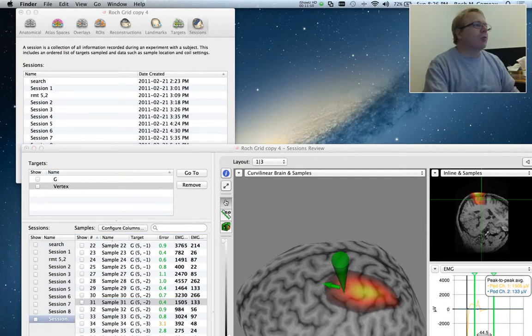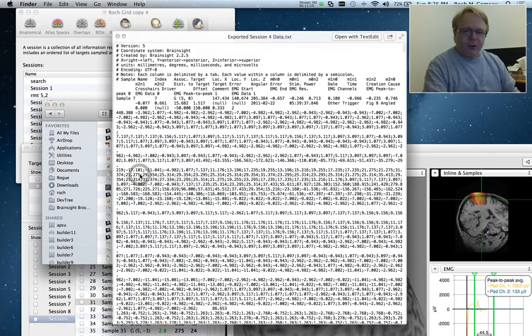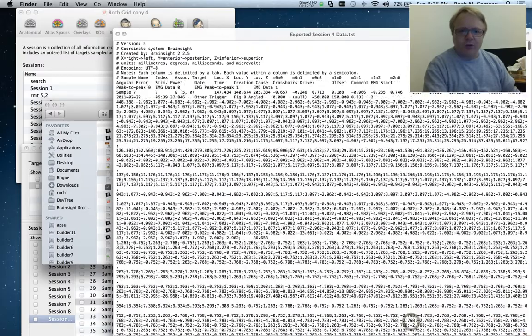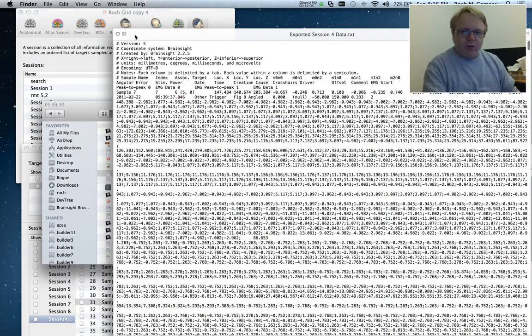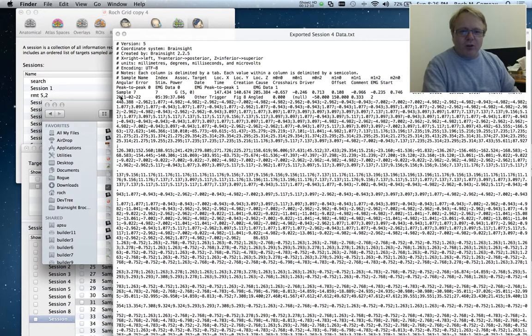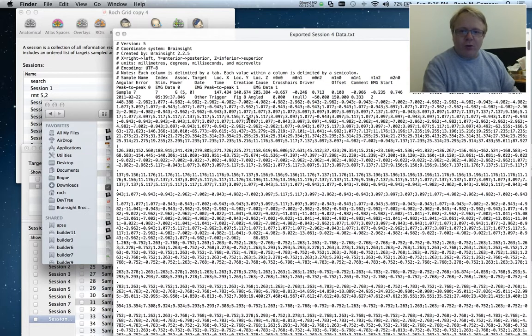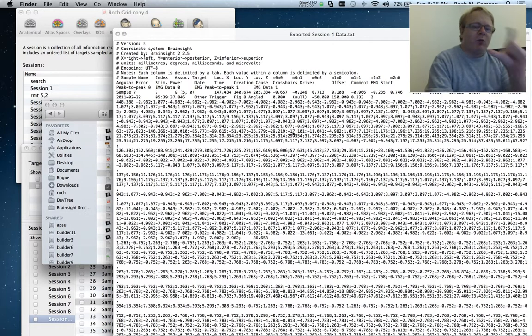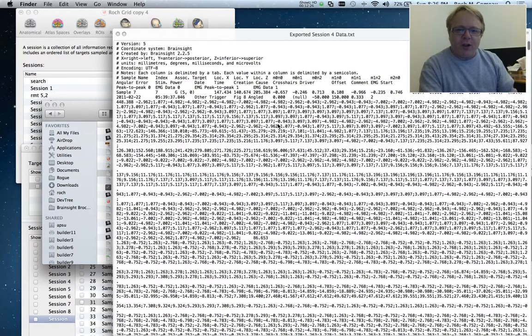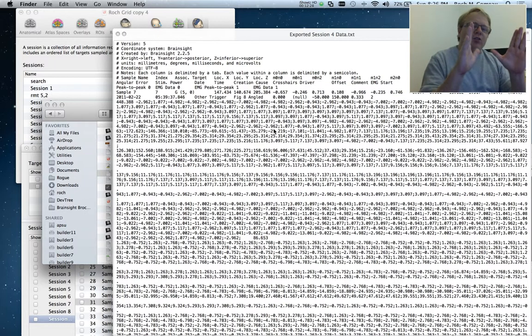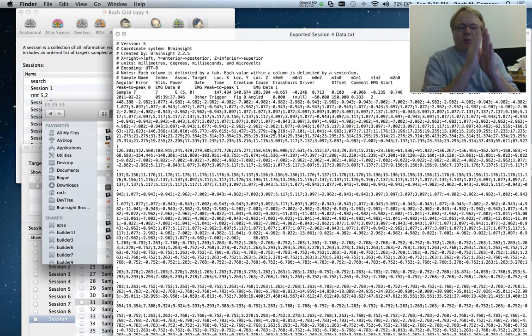And I'll just quickly look for an example of that. Let me just open up the sample data folder. So if I bring this folder here. So this is a quick example of the file. So there's always, at the beginning, a brief explanation of the data that was exported. And in each one, each piece of information has a tab between them. So the name, index number, associated target, x, y, z, direction, cosines. And then this pile of information over here is the waveform. So the waveform being one piece of information. Each sample is separated by a semicolon. So each field is separated by a tab. And each field with multiple entries, each entry is separated by a semicolon.